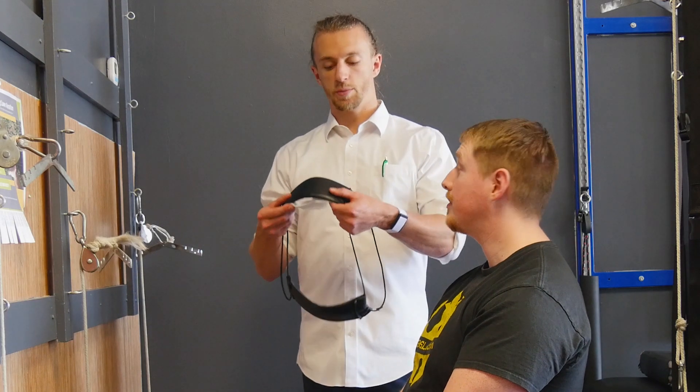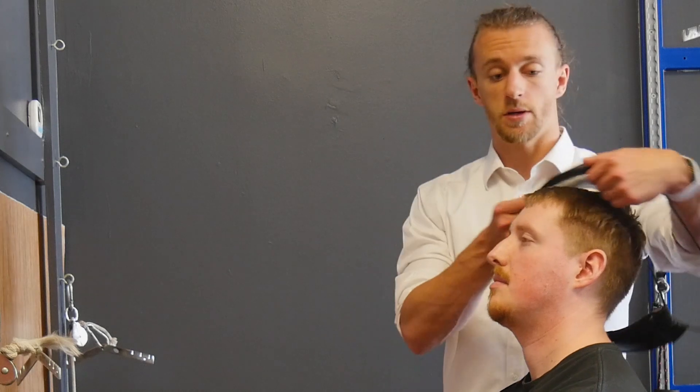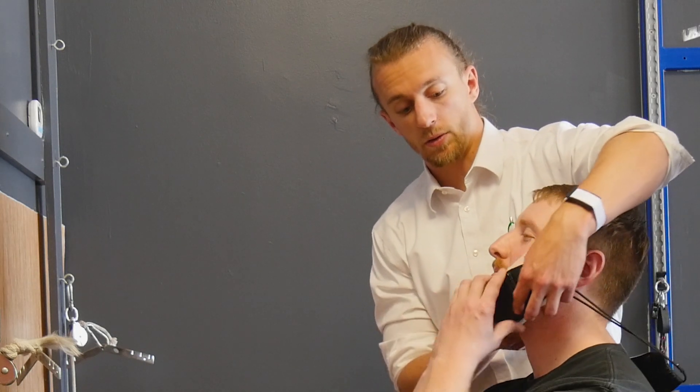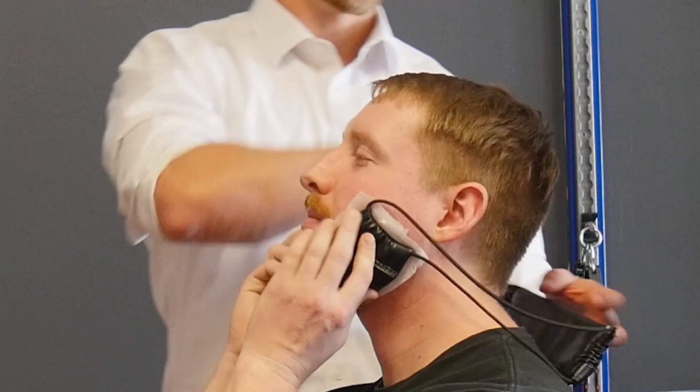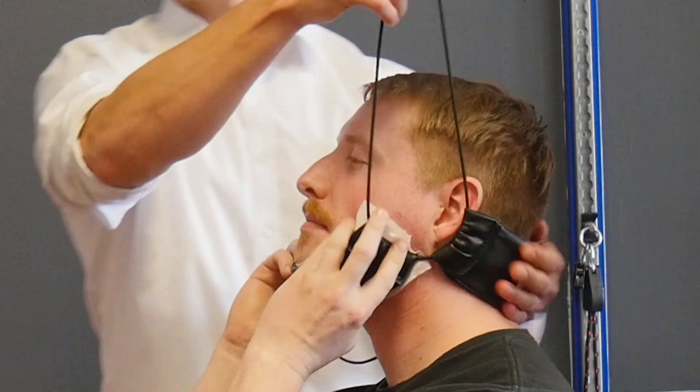Here's the head harness. We put some face paper because it's going to go right under the chin, and the other strap goes right behind the head. We set this up on Joel — go ahead and hold that against your chin — and then tighten up the strap so it's nice and snug against his head, so it lifts straight back.